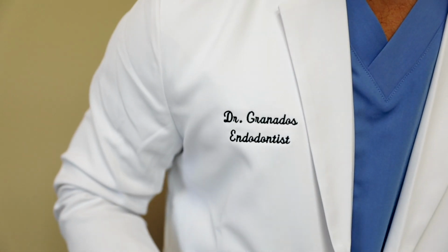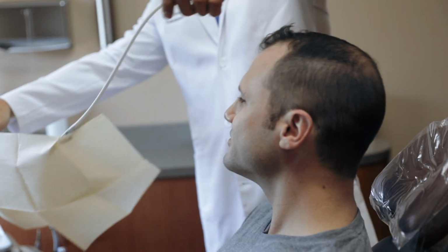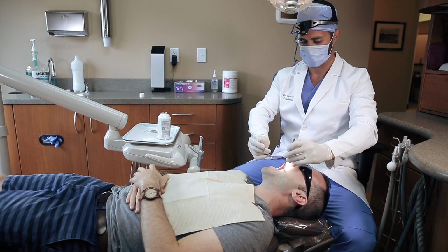Let's get into the most effective and efficient way to collect data and formulate an endo diagnosis. I'm going to walk you through exactly how I perform an endo exam at every patient's interaction with a live demo. Realize that this is meant to be a concise patient encounter, and like I always do, in an effort to not waste your time, especially your chair time, I'm going to show you the system that requires the least amount of testing and gets you the information you need as fast as possible so you can formulate your endo diagnosis and hopefully deploy those sweet endo skills you've learned.